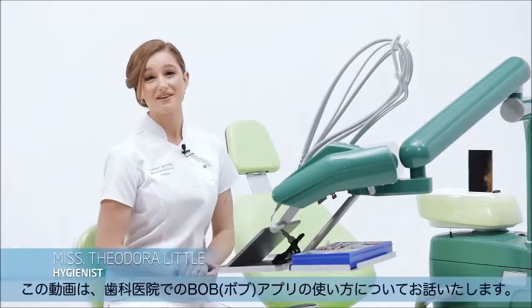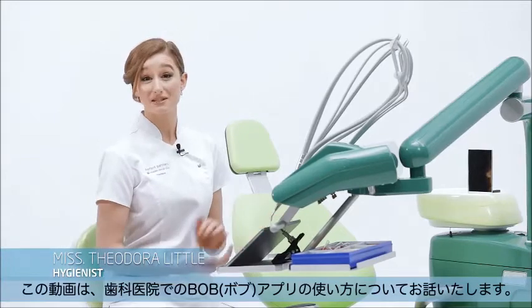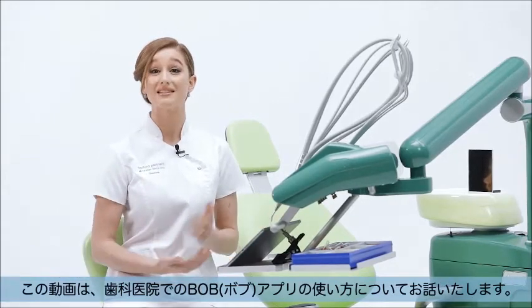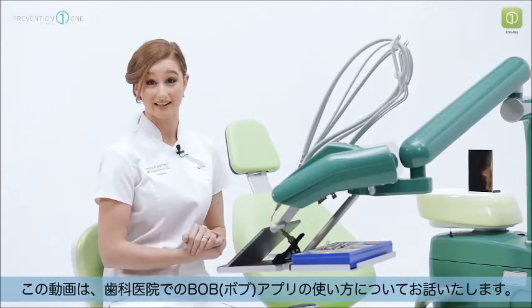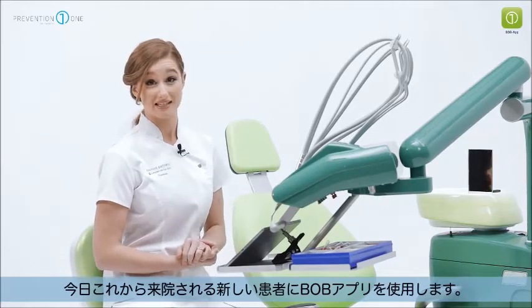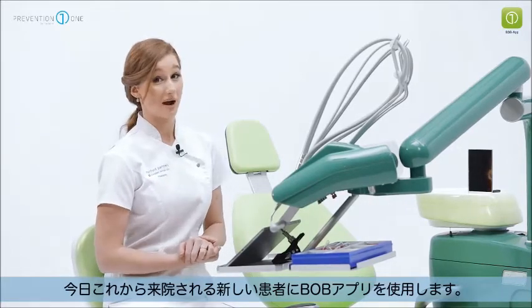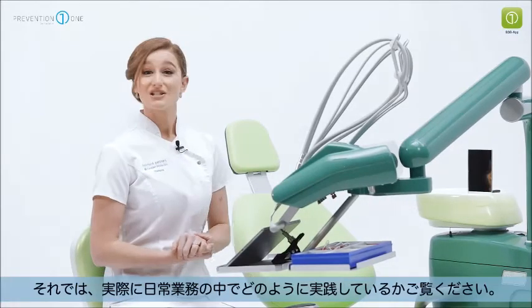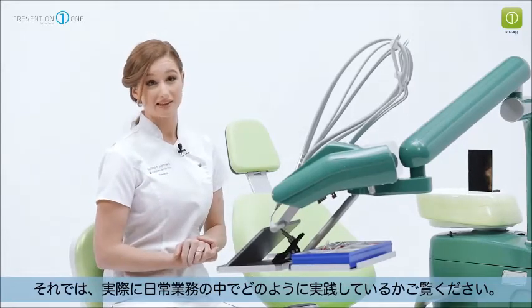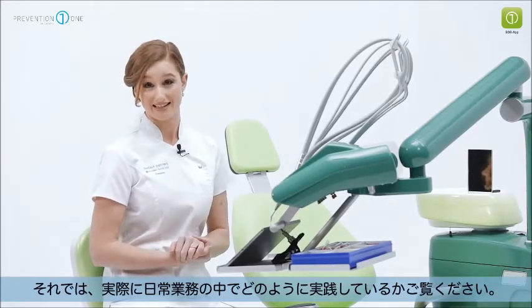Hello, it's Theodora here from Prevention One, and welcome to this video on how to use the Bob app inside the clinic. In a few moments I have a new patient with me today who I will be using the Bob app with, so let's take a look at how we actually implement this into our daily practice.